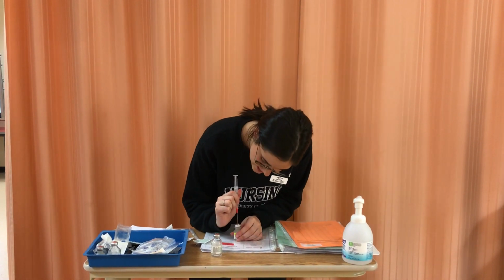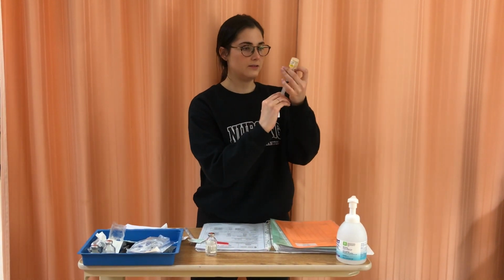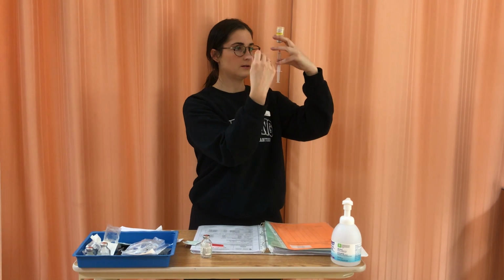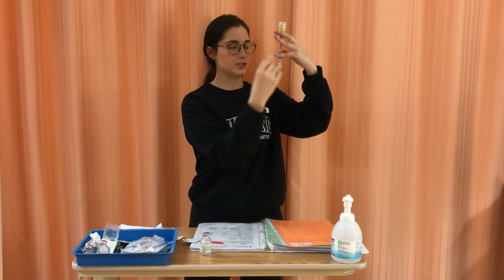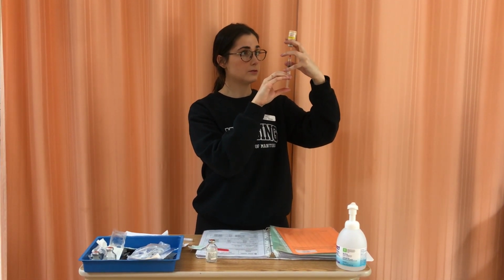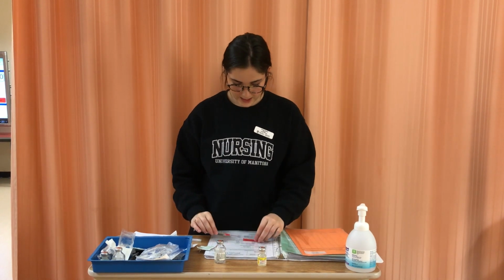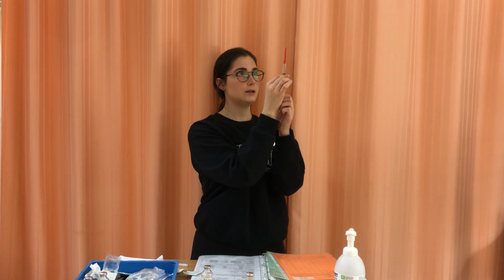And I'm going to inject air, invert it, get our required amount. Tap out the bubbles, being careful not to touch the plunger. Okay. So we're going to scoop this and just make sure we have the correct amount. So we have 3.1, perfect.